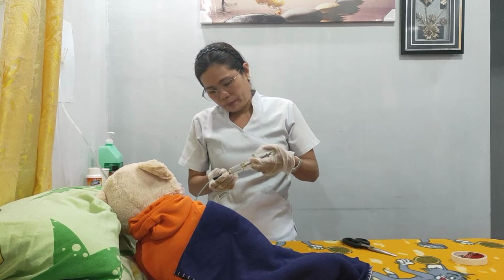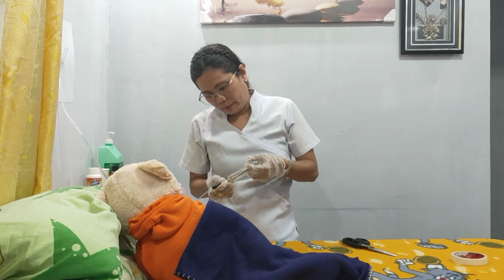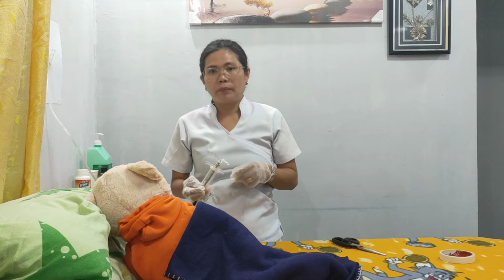Lay the patient on their left side. Inject 10 to 20 ml of air into the tube and make another attempt to withdraw gastric content. If you are still unable to get gastric content, wait for 15 to 30 minutes and try again. Prevent air entry into the stomach by pinching the feeding tube before connecting the syringe.